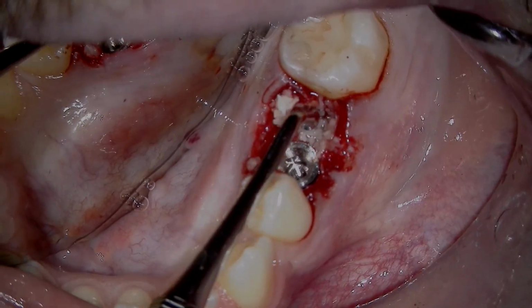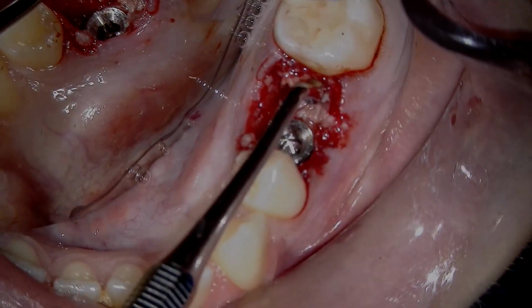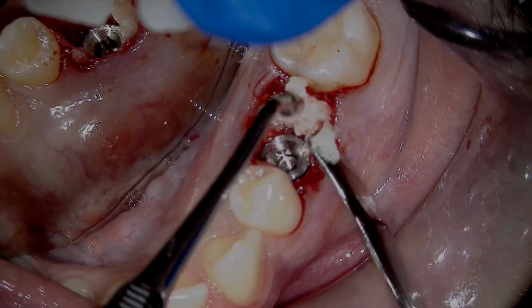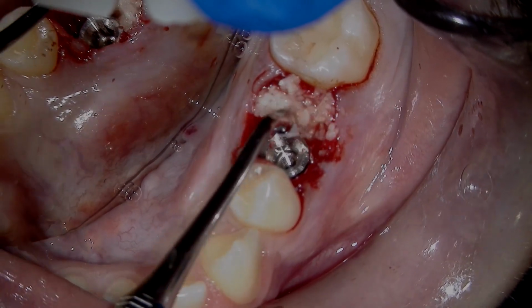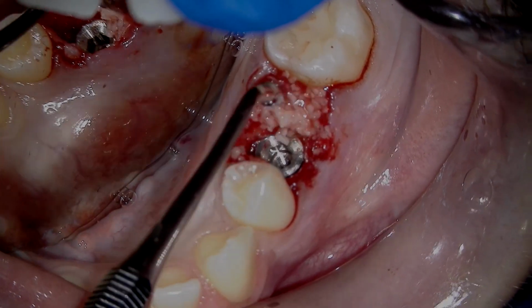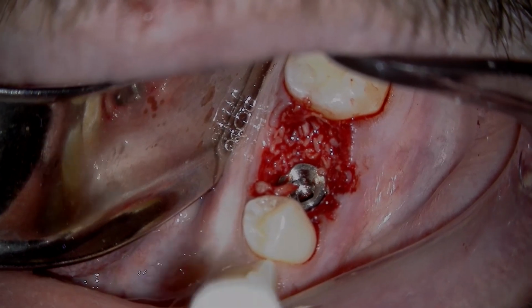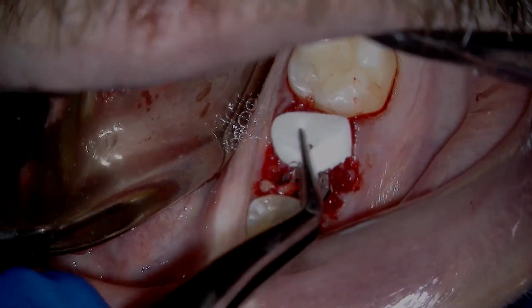Now the secret to packing this bone is you kind of let the blood work with you. I mean, the whole point of this is to form a clot and to feed this graft. So I'm not drying out this site. I'm working with the blood. And if there is excessive bleeding or excessive materials, you can use a surgical suction to clean things up. But for the most part, I just let the body do its thing.